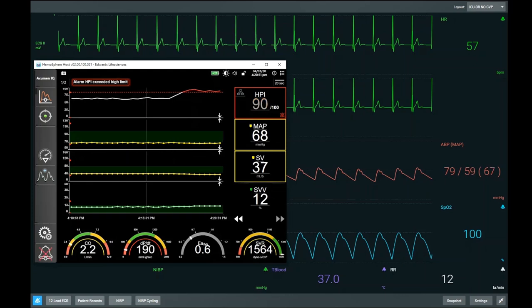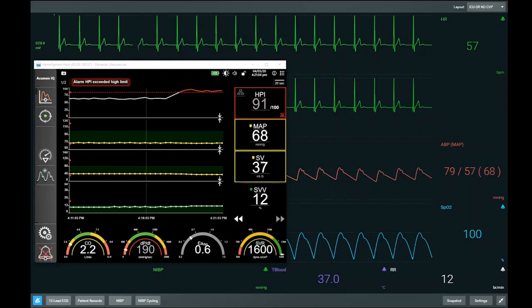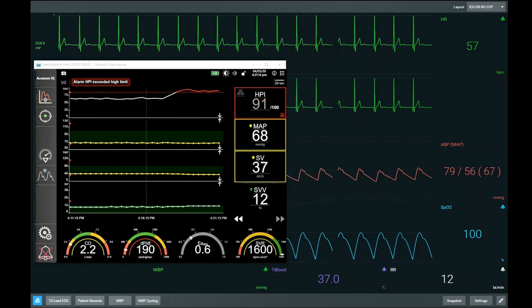We have to assume that our left ventricular end systolic elastance is equal to our left ventricular pressure time change, which is equal to this pressure time change in a peripheral artery. Now, of course, these things are not the same, but what dp/dt does is it tracks the changes in contractility, or true measures of left ventricular contractility.